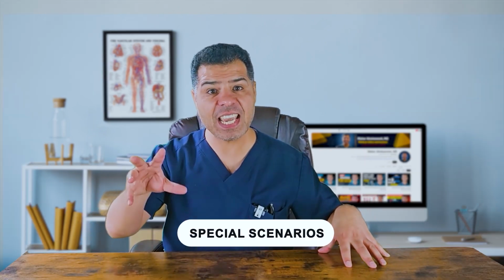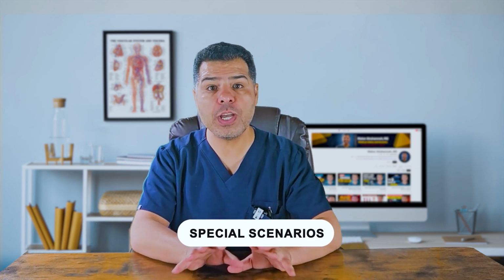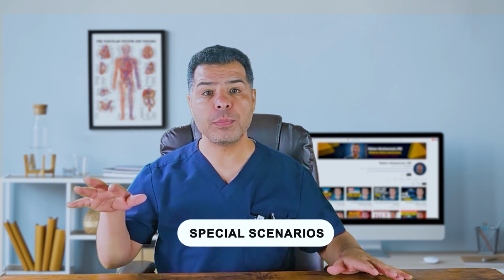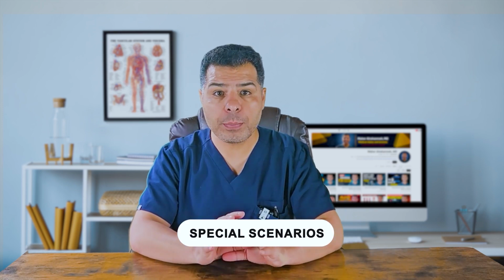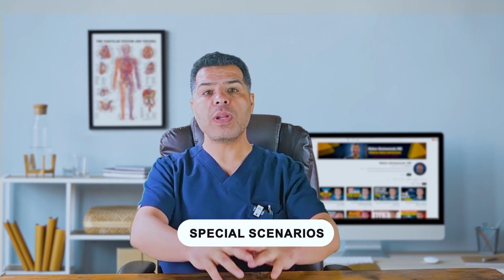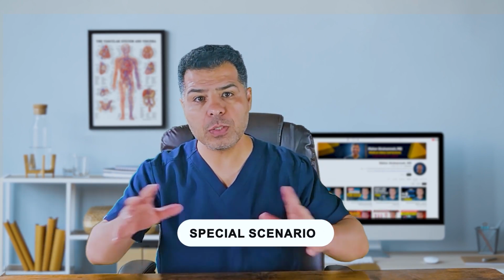Again, let's go over some special scenarios, which I already mentioned, in CKD or end-stage renal disease. Avoid subclavian and PICC lines to preserve future dialysis access. Use IJ or femoral if temporary access is needed in these patients. In cancer patients, ports are best for long-term intermittent therapy. For patients going home on IV antibiotics, midlines or PICC lines are ideal, depending on the duration.